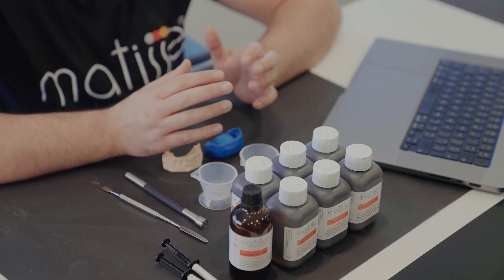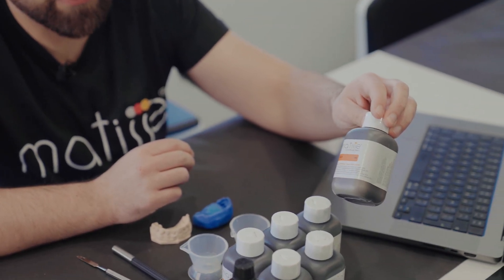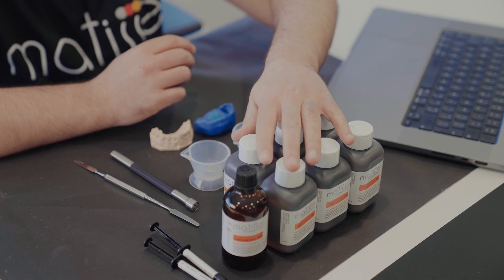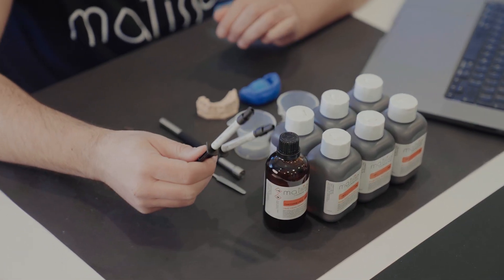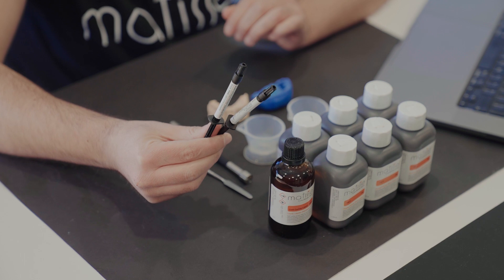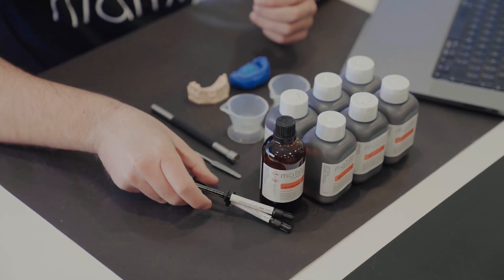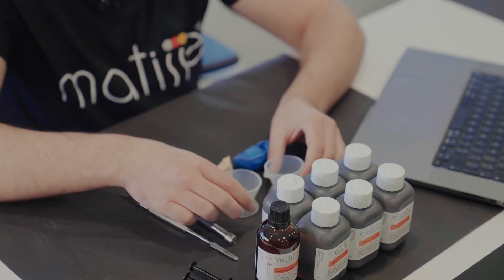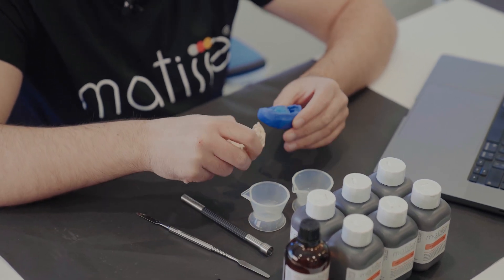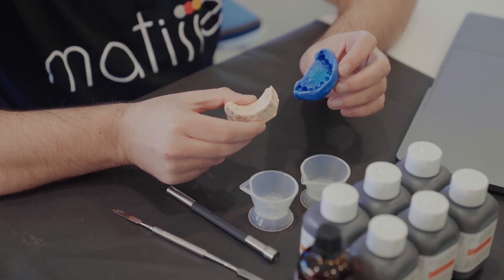To make an aesthetic model you need a couple of things. First, you need the Matisse color model resin full kit, which has six colors — six acrylic colors, cold curing liquid, and two flowable stains: flowable composite stains black and brown, to make characterizations on the preparation if there is some discoloration. You also need mixing bowls, a portioner, a mixing spatula, and a silicone index of your gypsum model or 3D printed model.